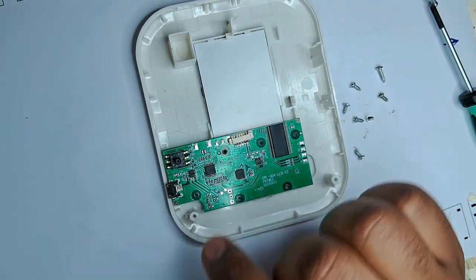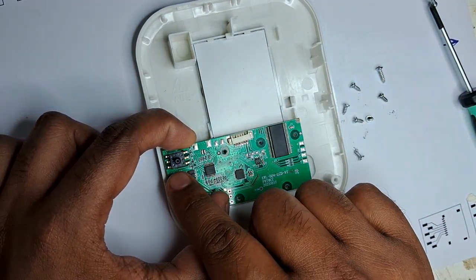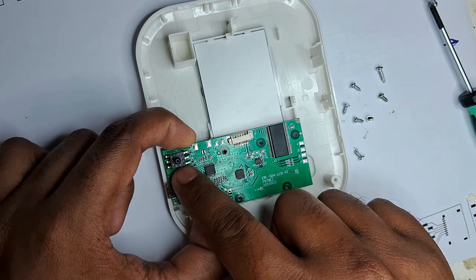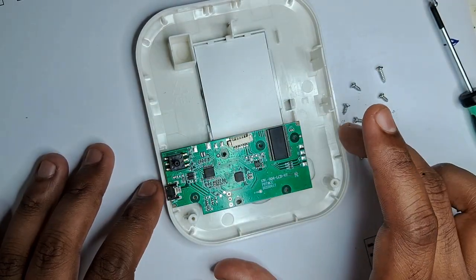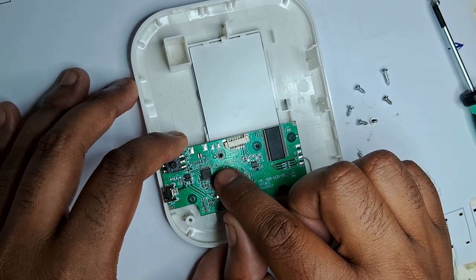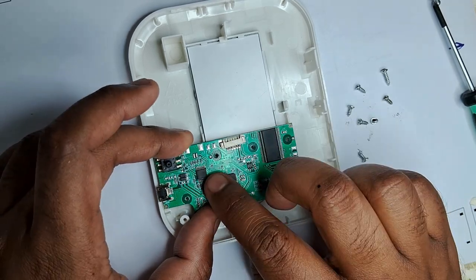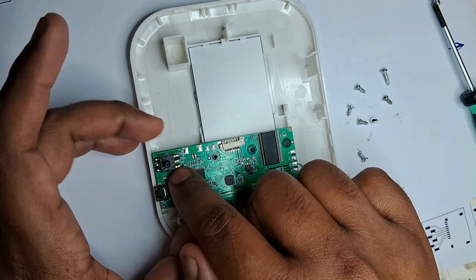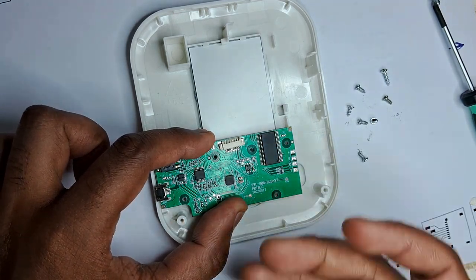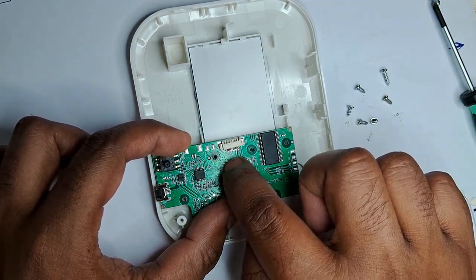Okay, this is a pressure sensor, which is responsible for converting the pressure into electrical signals. And mostly these sensors are developed around the concept of strain gauges. And this over here is an operational amplifier. Basically, I should say an arrangement of operational amplifiers converted into an instrumentation amplifier. We will dive into the data sheet of this sensor also. And this over here works as the LCD driver. And this is the connection for the valve and motor.